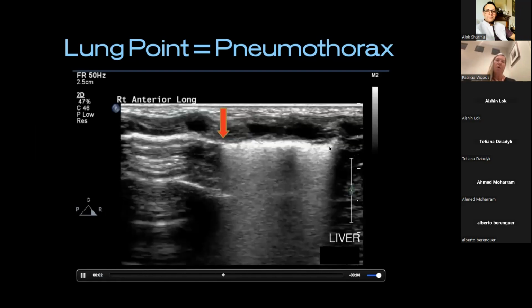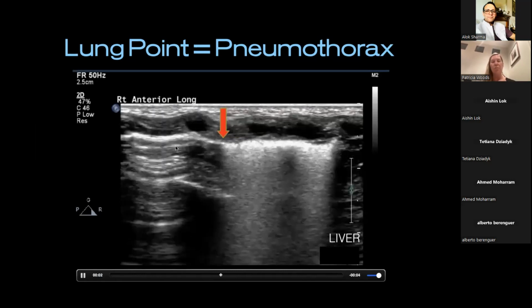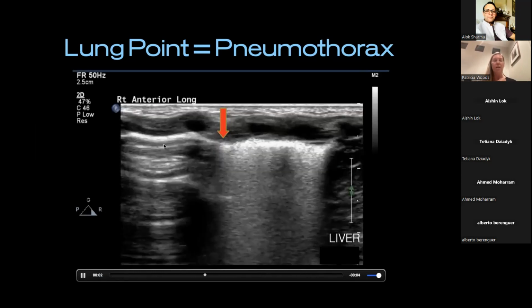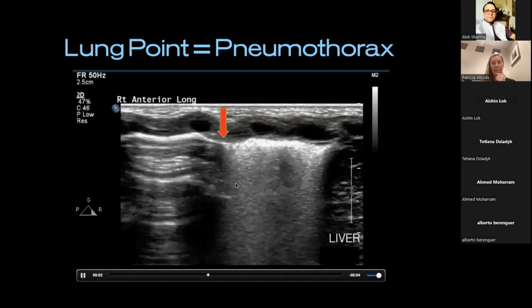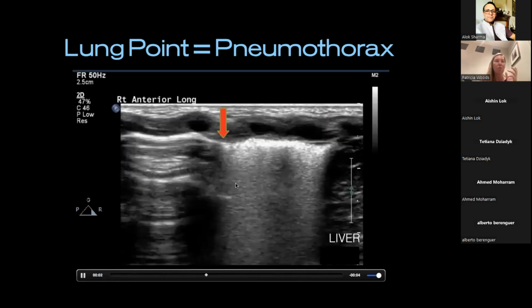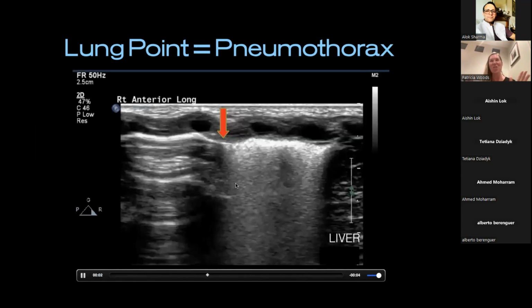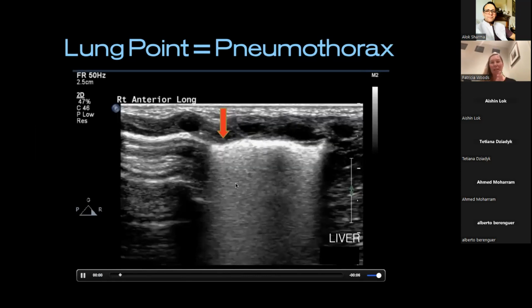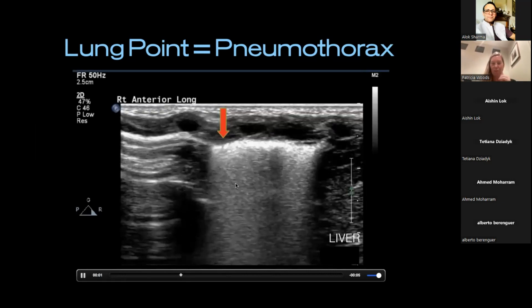So here I would describe lung point within one intercostal space where you've identified a sharp transition in the quality of the pleural line, the nature and movement of this pleural line, and the dominant artifact profile of A-line presence or coalescent B-lines, and nothing else gives you that image. There are other discussions about false lung point, and it gets really confusing, and double lung point that you might get in a transition of B-line coalescence that changes with gravity and fluid clearance as in TTN, but it's not as exciting as this. It's not a sharp and accurate transition.